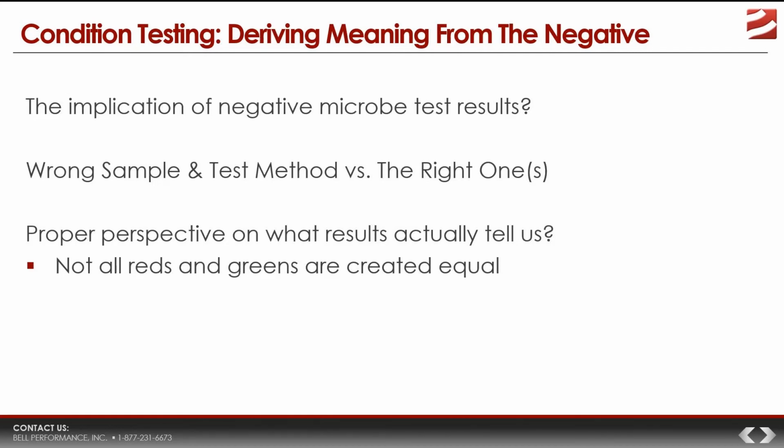Now, so you have to keep that in mind. We also, with respect to ATP testing, have some nuances that we have to remember even when we're getting those kinds of test results. With ATP testing, typically, depending on whether you test fuel or water, you'll get a microbial equivalent number. And then, depending on whether it came from fuel, if it's above 10, you're going to get a red result. If it's between 1 and 10, you're going to get a yellow, which is kind of like the yellow caution light. It means you need to start paying attention. If it's below 1, it's green.